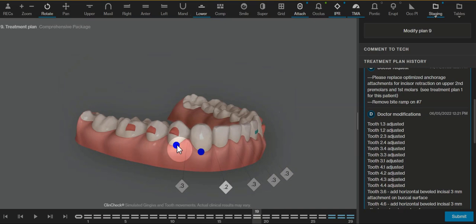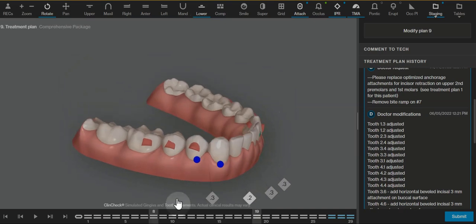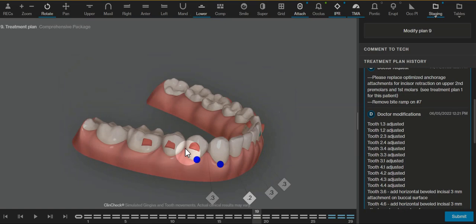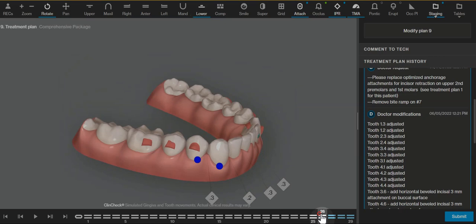Which is why I added an additional retention attachment on the first molar so that this aligner has a really good grip all the way through here and delivers that intrusion force most accurately.